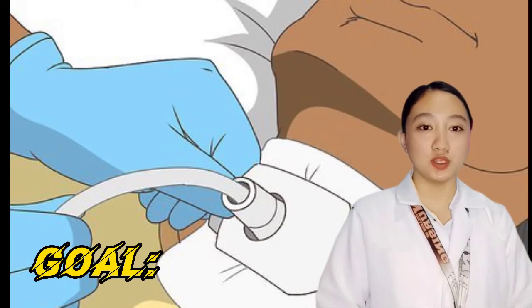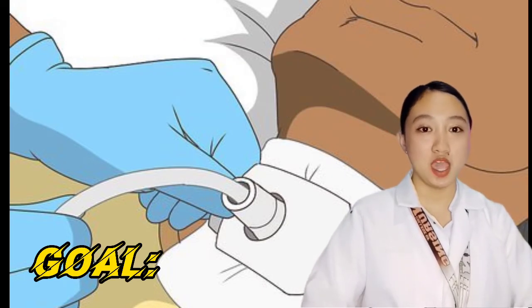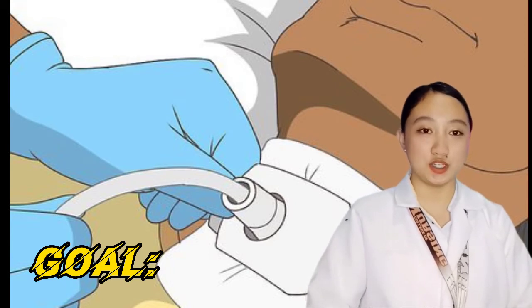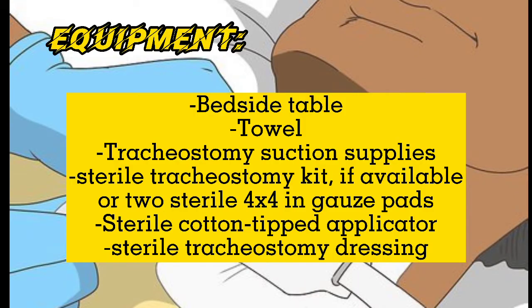For the goal: the patient exhibits a tracheostomy tube and site free from drainage, secretions, and skin irritation or breakdown.